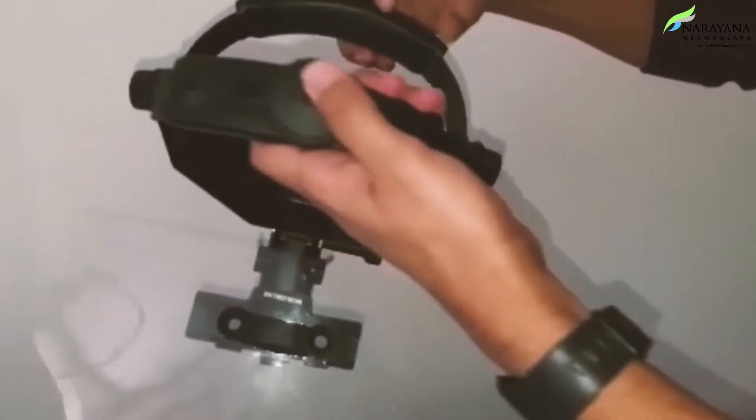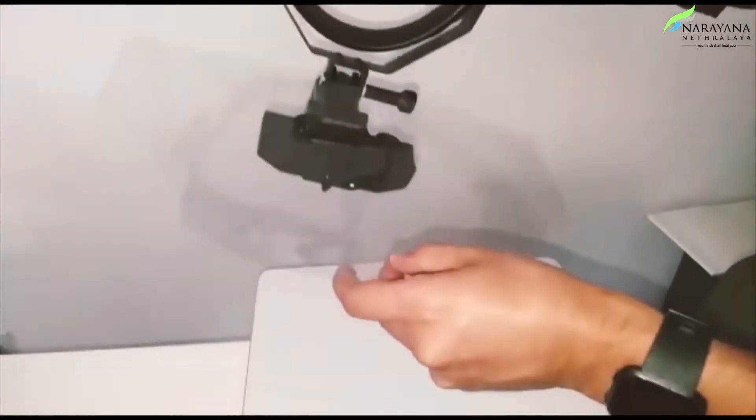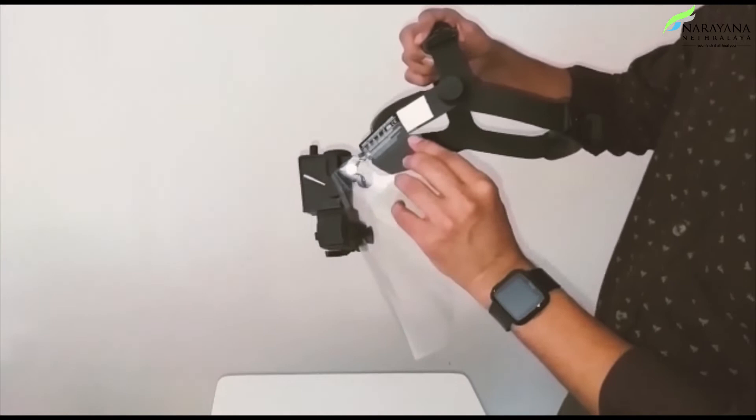Fix two pieces of adhesive foam on either side of the IDO headband. Place the sheet on the eyepiece and stick it on either side.